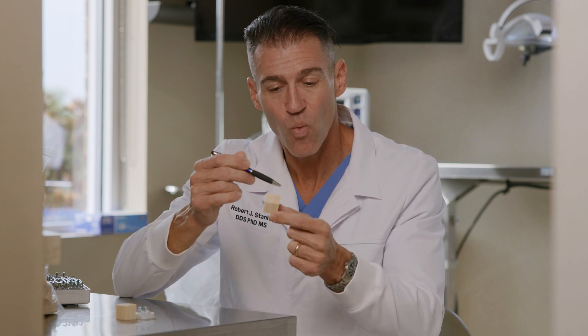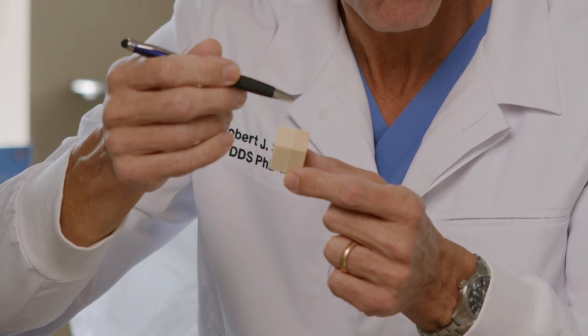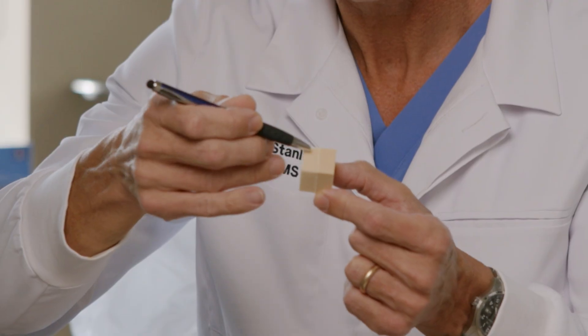These two blocks illustrate exactly why you should go guided with all your implant surgeries every time. Here we have our foam block experiment. We have a one inch by one inch by one inch cube made out of foam. On one side we have a representative D1 bone, which is dense foam representing compact bone. On the other side we have D4 foam designed to represent spongy bone. They are laminated right down the center.